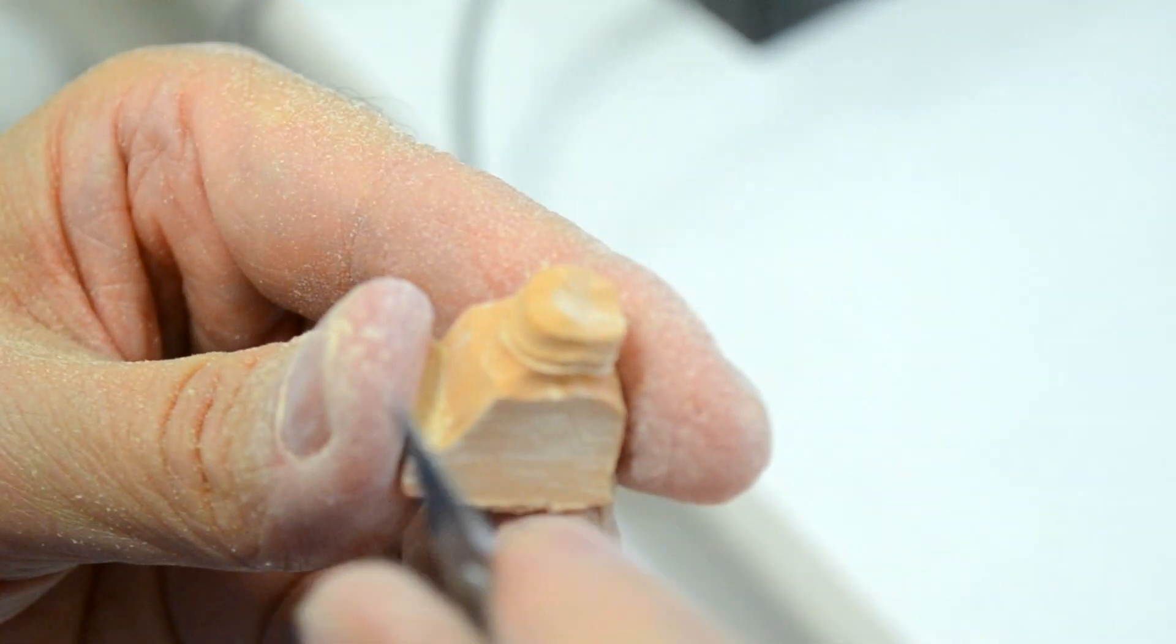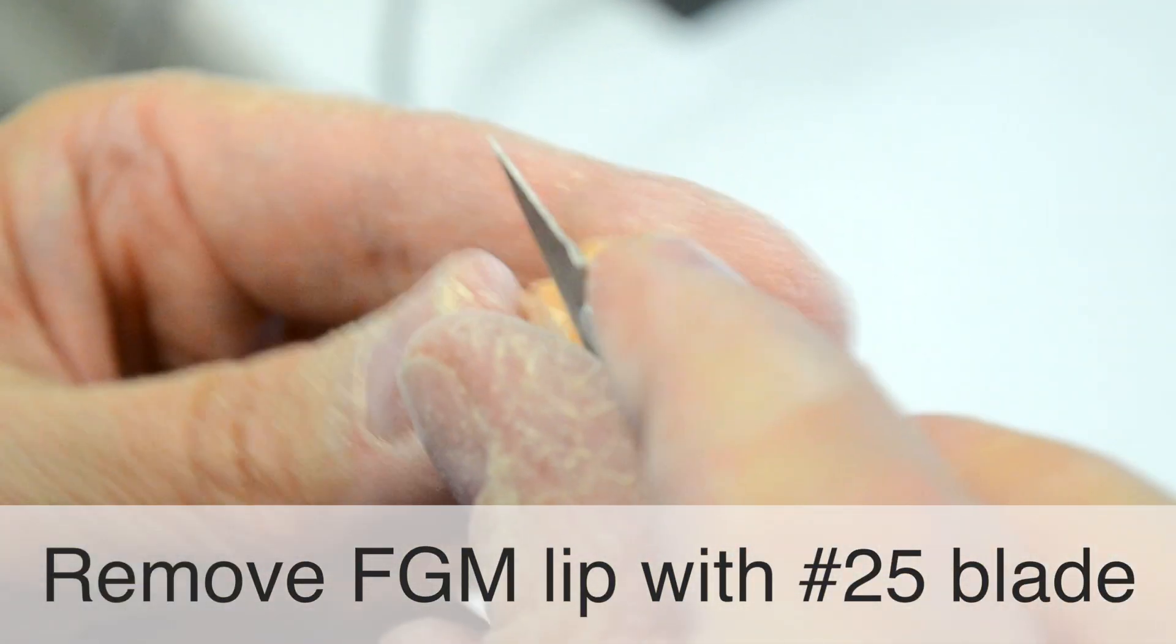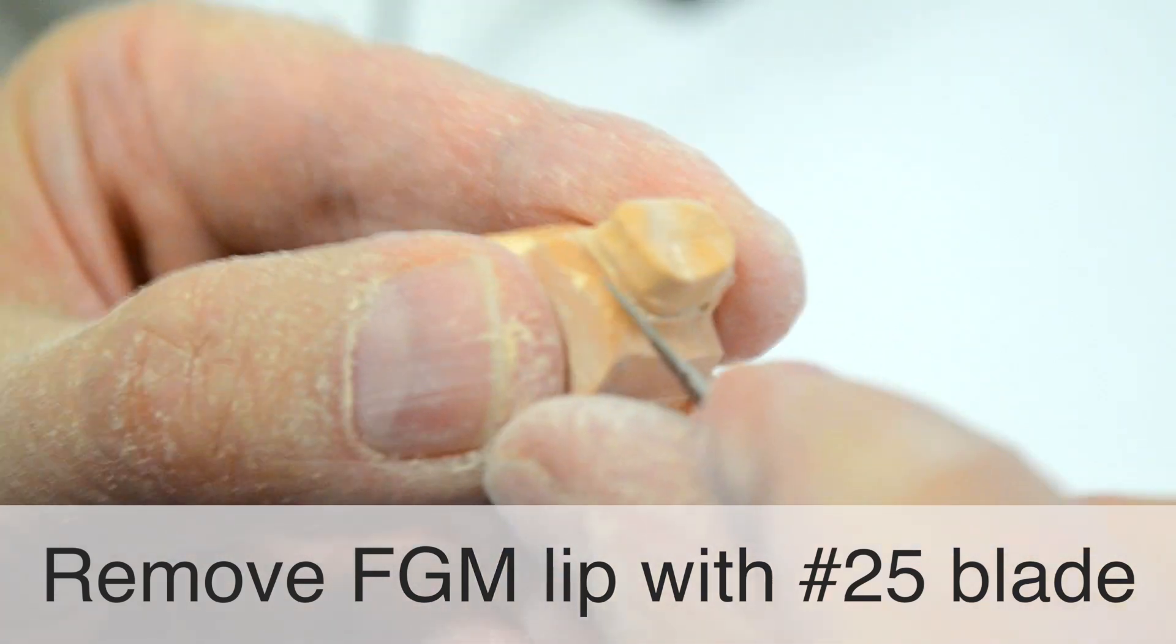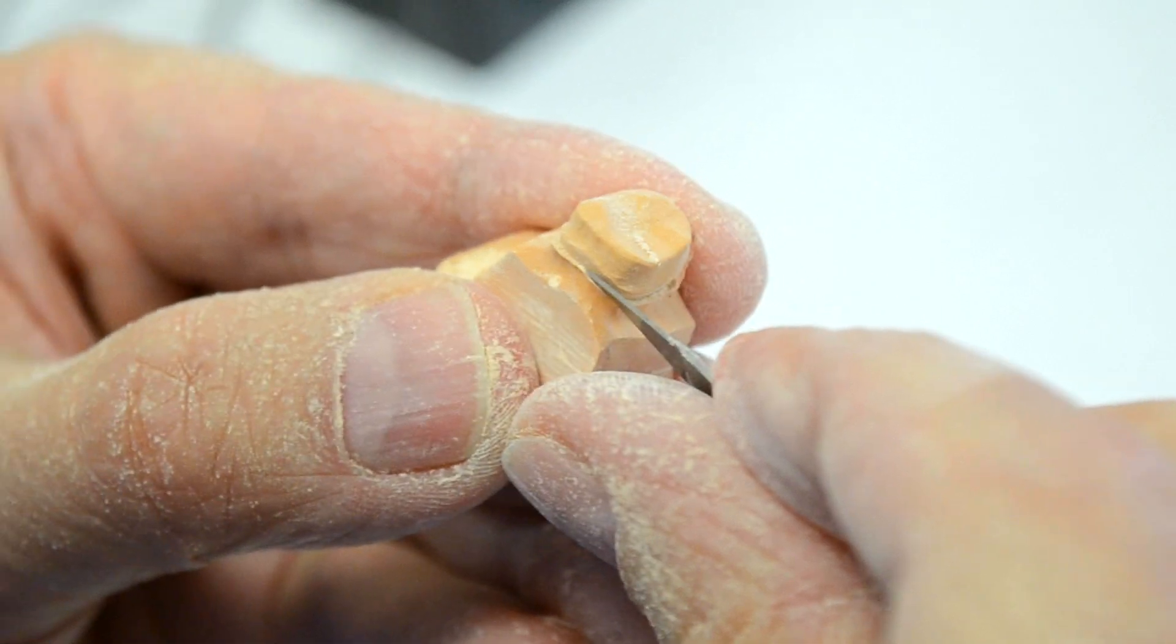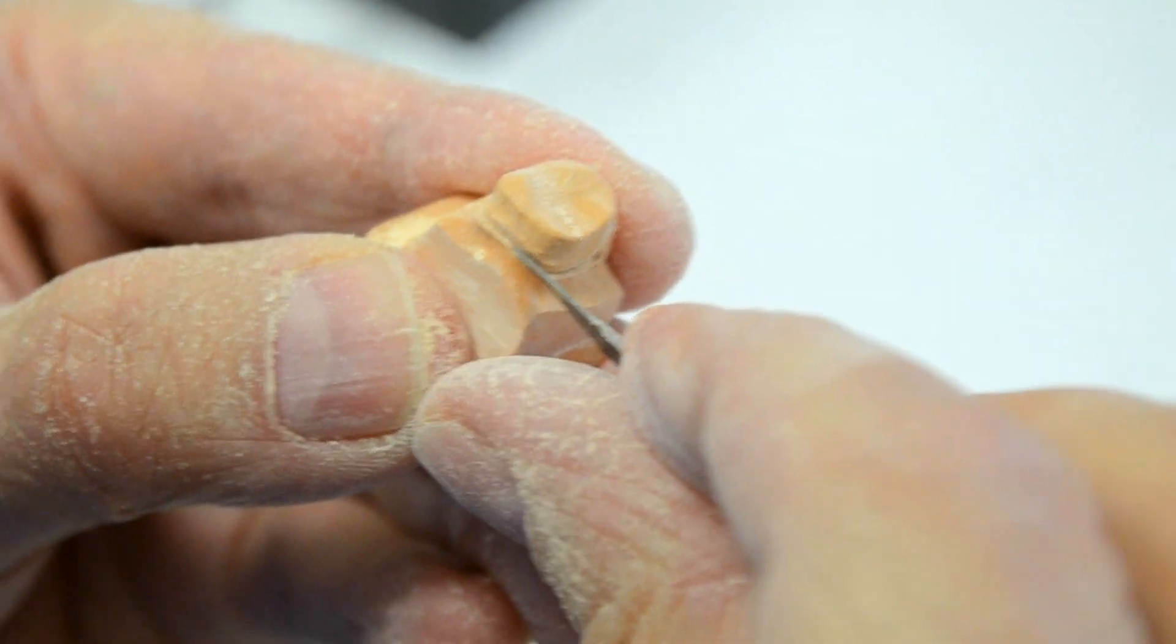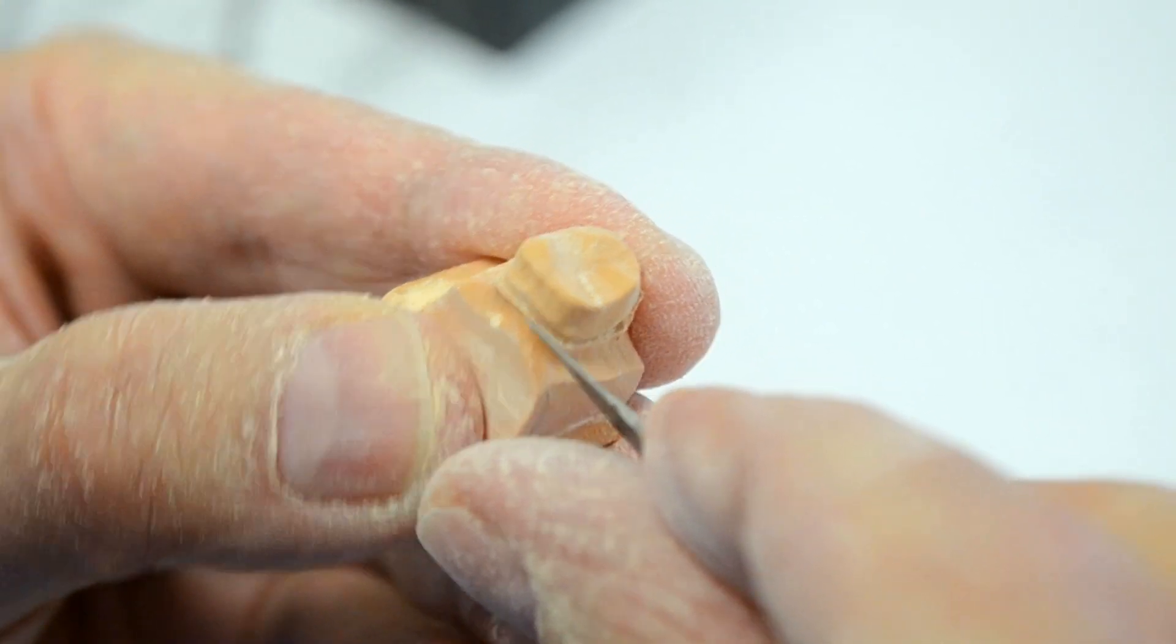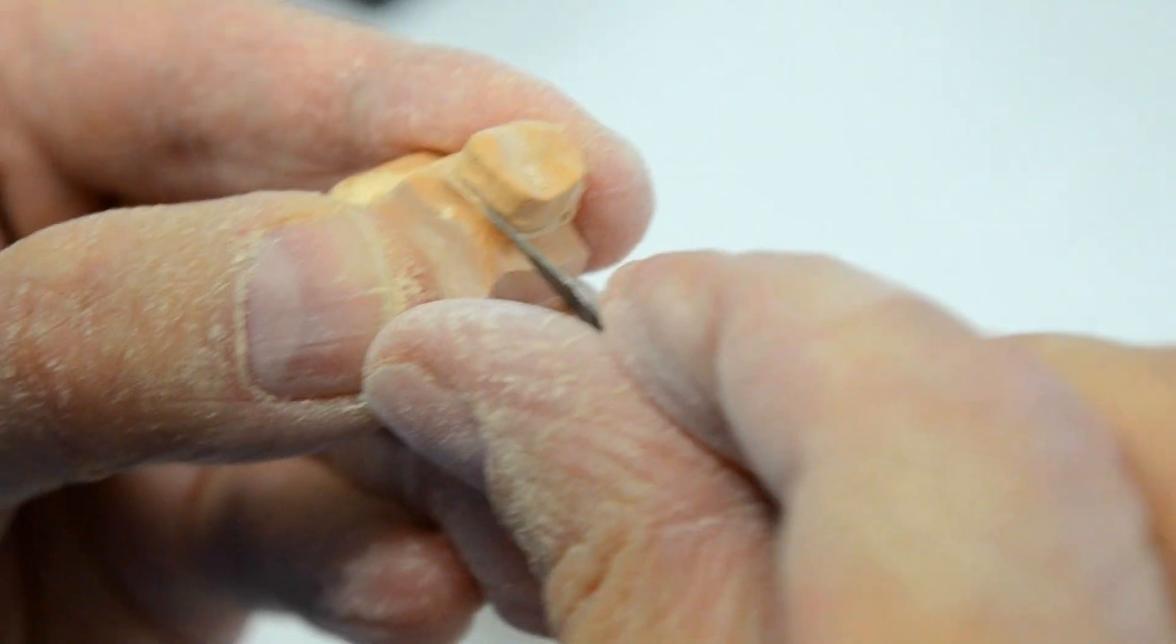The very next step involves removing that portion of stone using a number 25, very sharp blade, preferably a new blade that is less apt to slip and cause you to cut your finger. The other advantage of a very sharp blade is the fact that you will not have to exert nearly as much pressure when removing the stone.